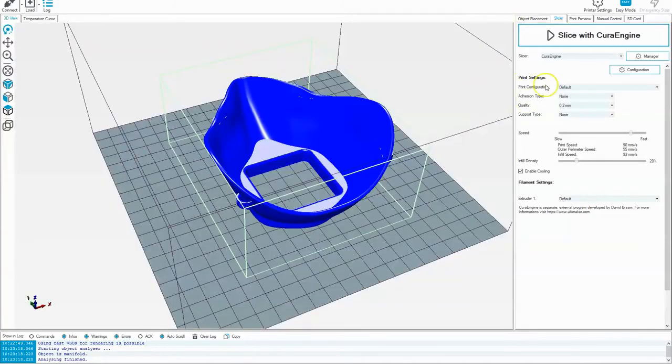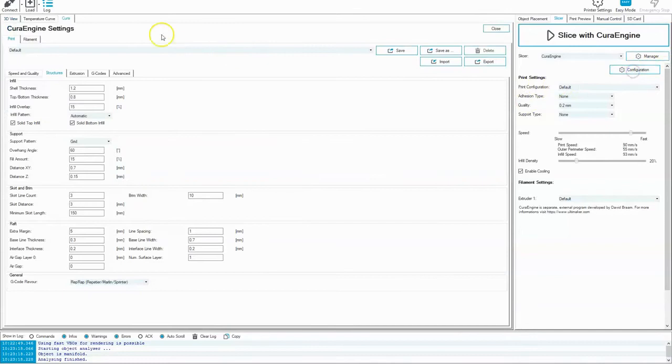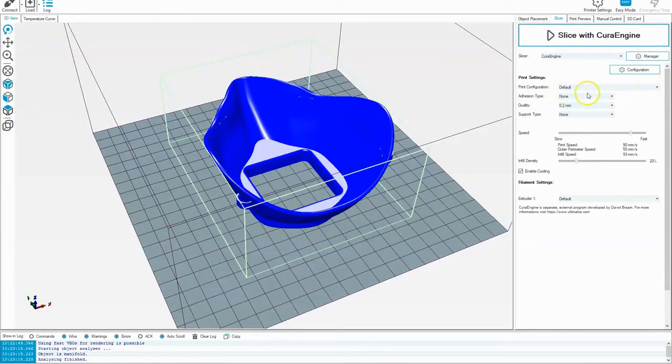Now, this was the default print configuration. If I jump back in here, you can see it says default. So I'm just going to leave this as default. We're not using adhesion. Quality is at 0.2. Support type none. I'm going to keep my speed around 90, and I'm going to keep my infill at 20%.